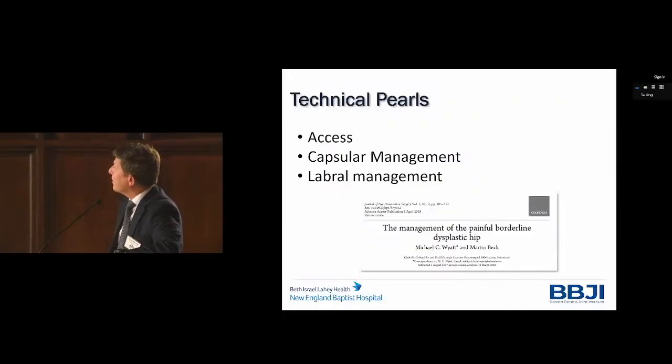So technical pearls: the way I break it down is access, capsule management, and labral management. I'm not going to talk about the rim, because in this setting, dysplastic patients probably don't want a ton of rim work. Subspine impingement you want to address, or if you have an everted labrum, you might do an advancement and address some bony side here on the acetabulum. But otherwise, it's just access, capsule management, and labral management.